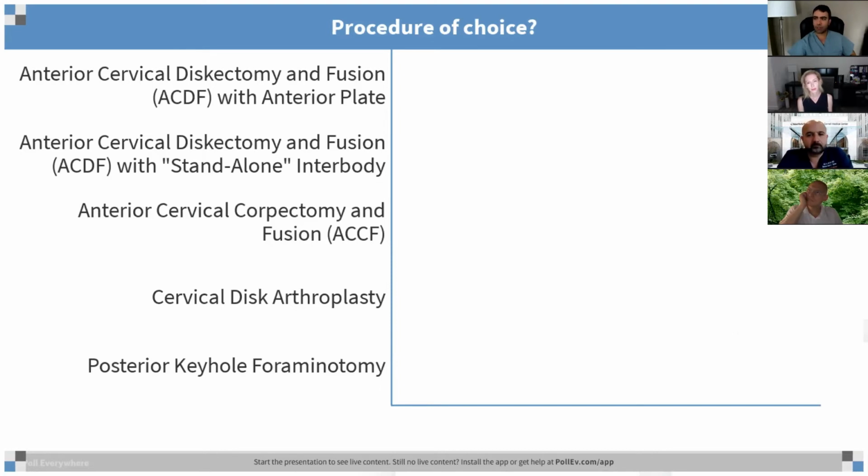So for the vast majority of our practices, we do ACDF, and that's what we predominantly do here at Cleveland Clinic. By the time you get that perfect arthroplasty candidate, you're just so used to ACDF. It's predictable results, and it's been around for a long time. If those patients have subtle myelopathic symptoms, which they sometimes do, you know what you're going to get with ACDF. It's a little bit unclear with arthroplasties. Also, with the nuances of the surgery itself, there's more at stake with an arthroplasty.